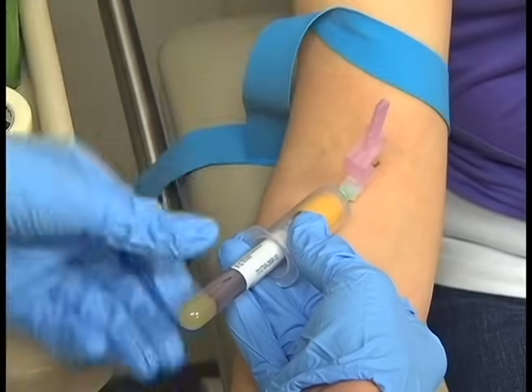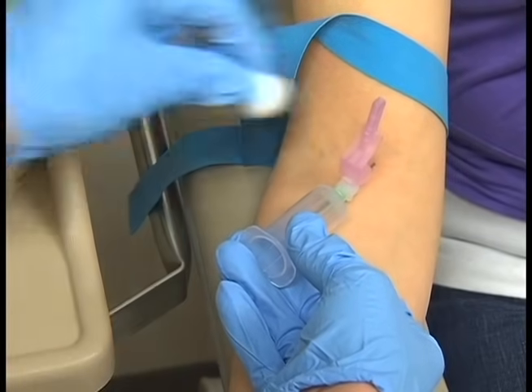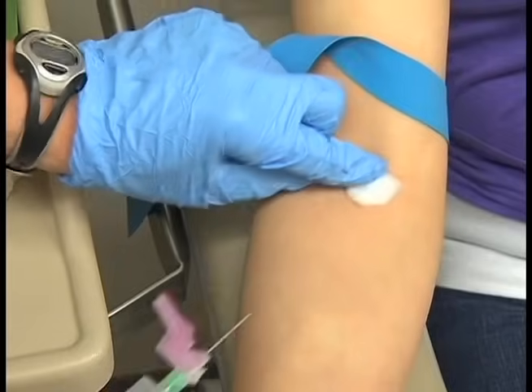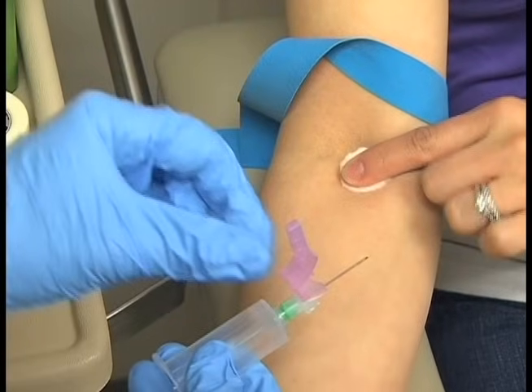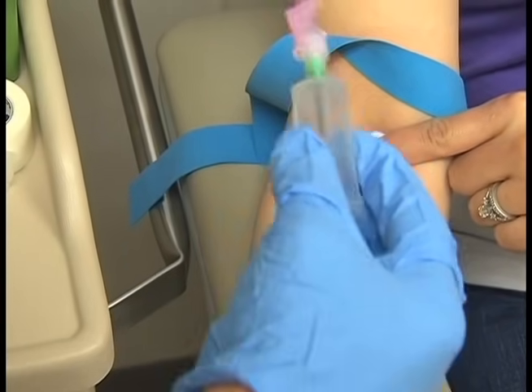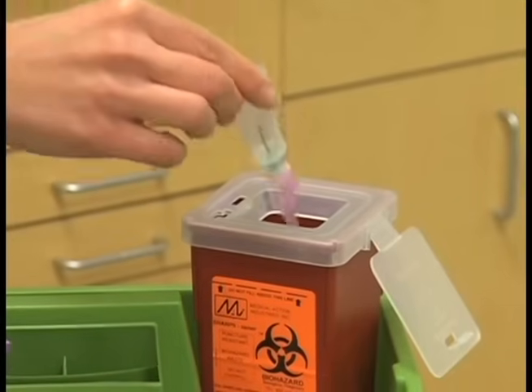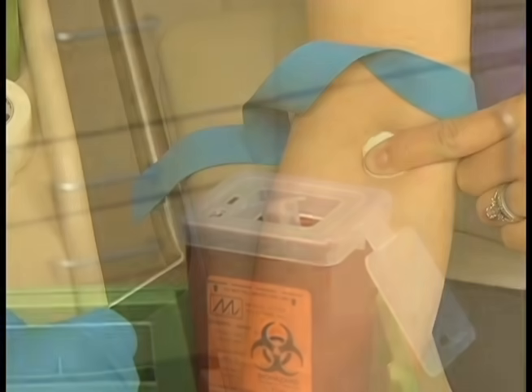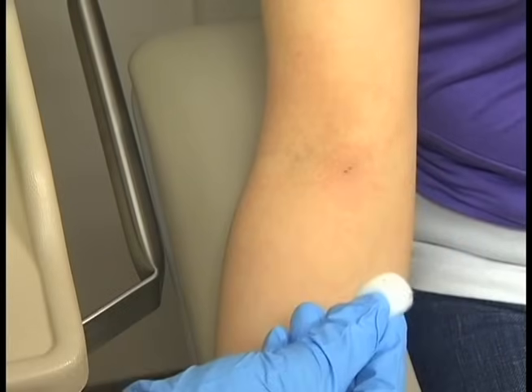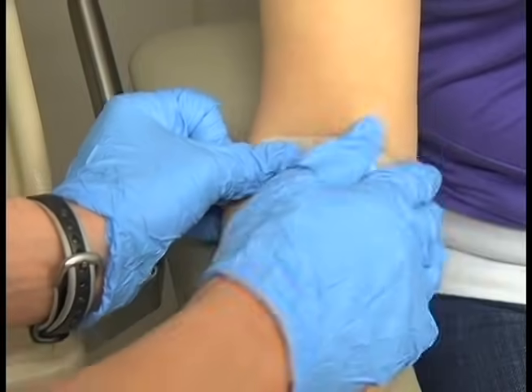Stabilize the vacuum tube setup by firmly grasping the holder between the thumb and underlying fingers to prevent the needle from moving. Place a cotton ball slightly above the puncture site and carefully withdraw the needle at the same angle used for penetration. Immediately move the cotton ball over the puncture site and apply firm pressure. To activate the safety shield, push it forward with your thumb until you hear an audible click indicating it is locked in place. Immediately discard the plastic holder and attached needle in a biohazard sharps container. Cooperative patients can be asked to apply pressure with a cotton ball for one to two minutes. Remove the cotton ball, inspect the puncture site to ensure the opening is sealed with a clot, and apply an adhesive bandage.